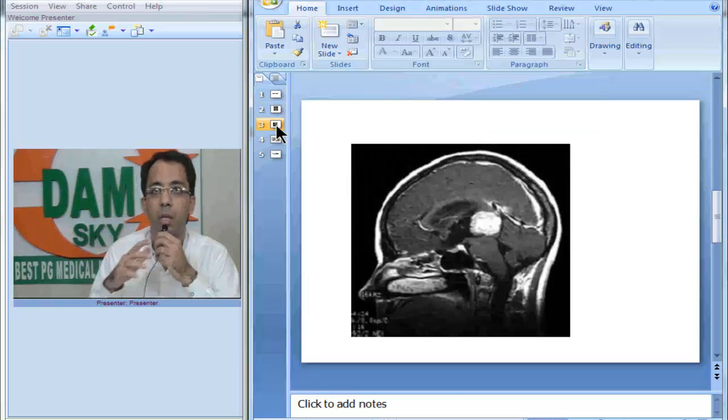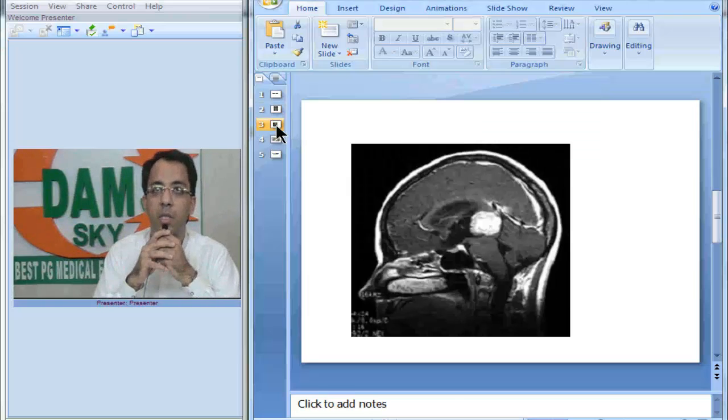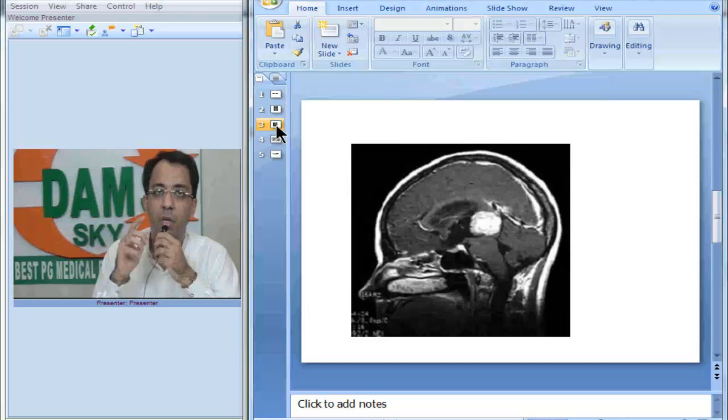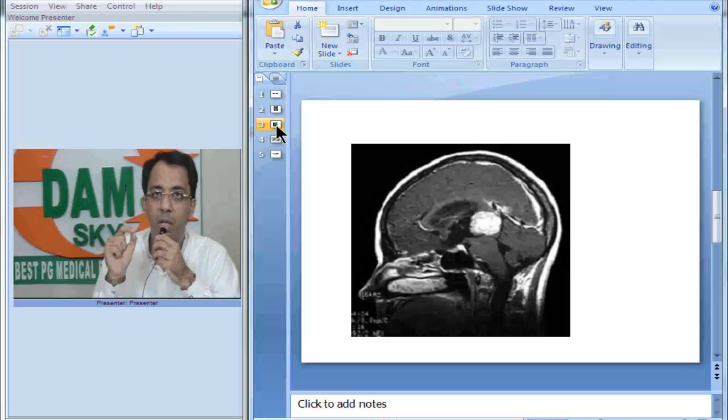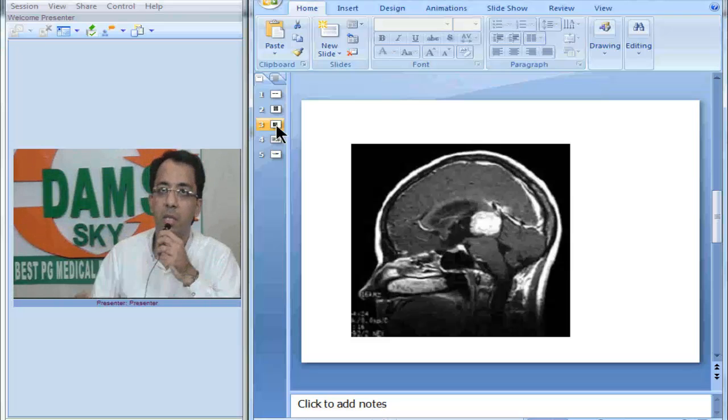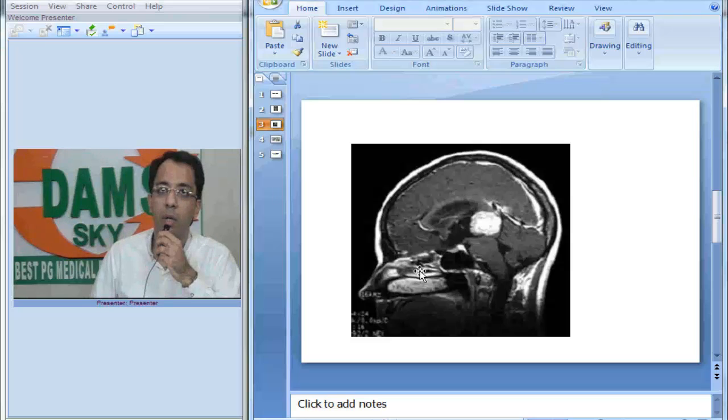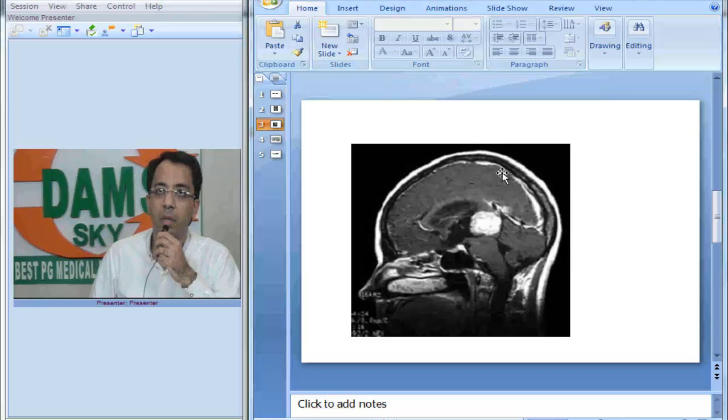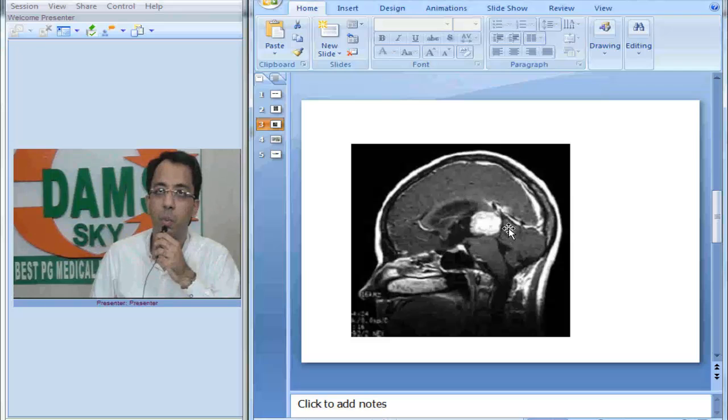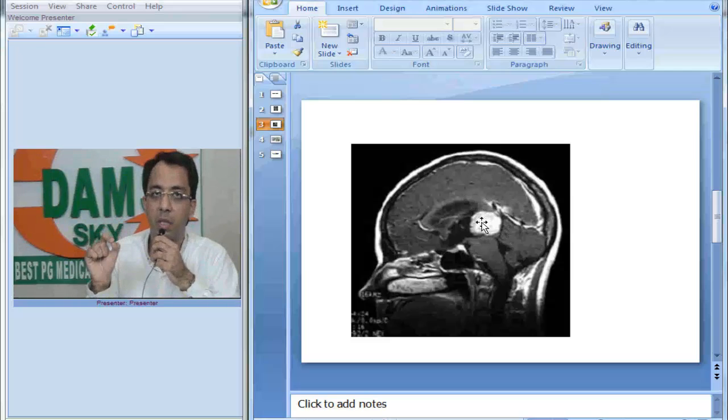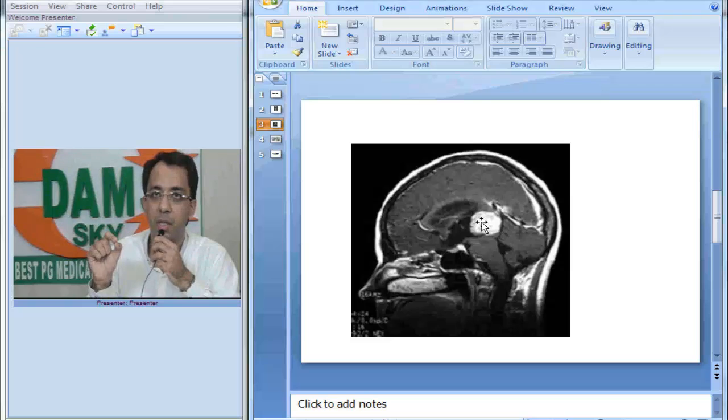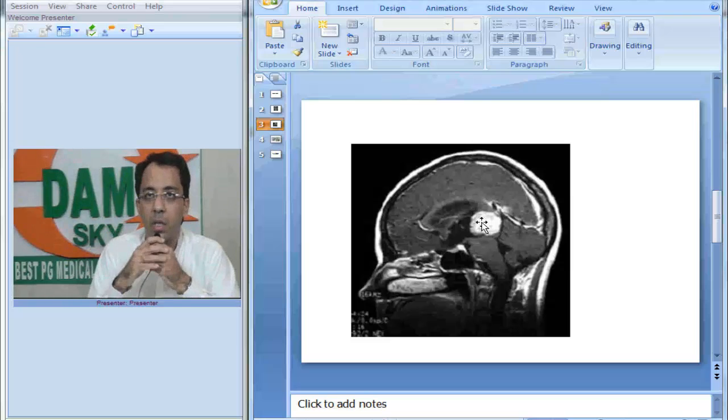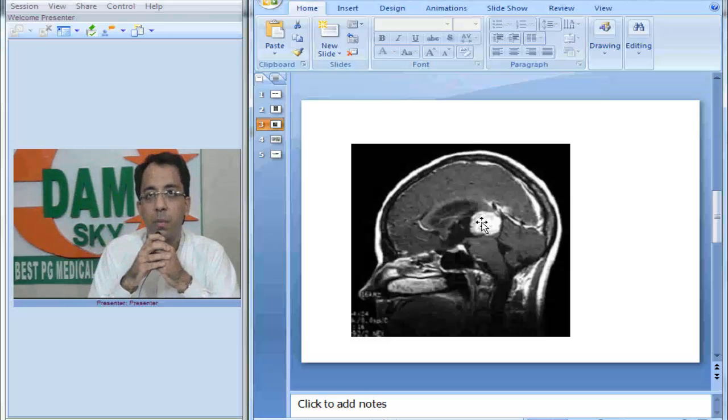What do we see? Now if you look at the sagittal image, this is again a T1 post-contrast sagittal image. If you look at this image carefully, you will see there is some enhancement here but you will see that tumor again. It is in the posterior part of the third ventricle, homogeneously enhancing below the splenium of the corpus callosum.